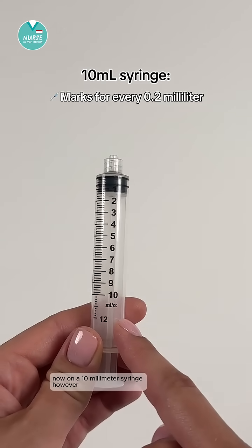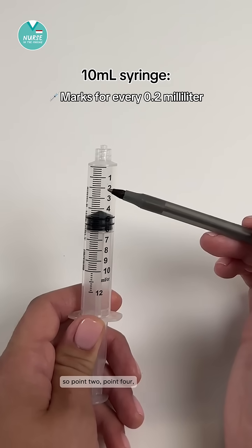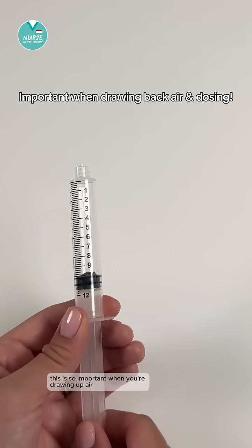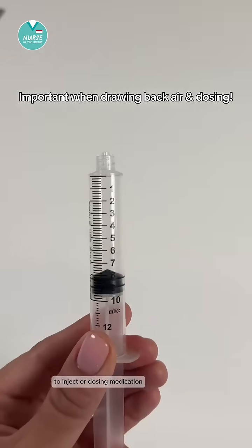On a 10 milliliter syringe, however, there are marks for every 0.2 — so 0.2, 0.4, 0.6, and 0.8. This is so important when you're drawing up air to inject or dosing medication.